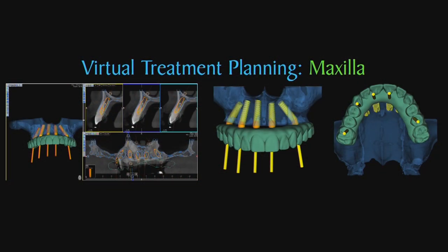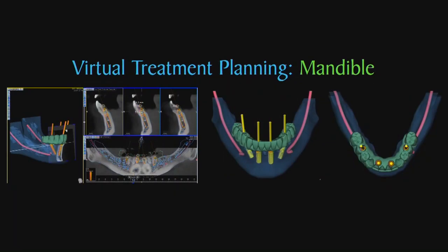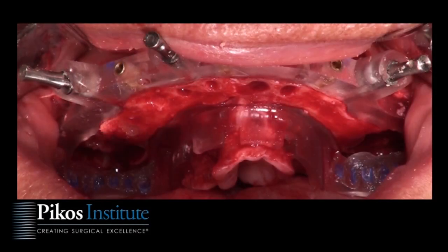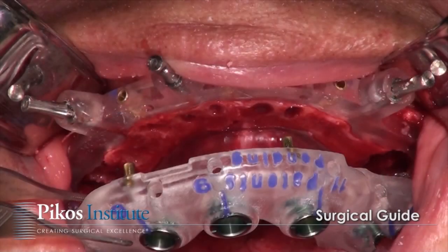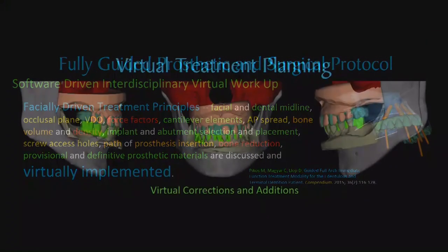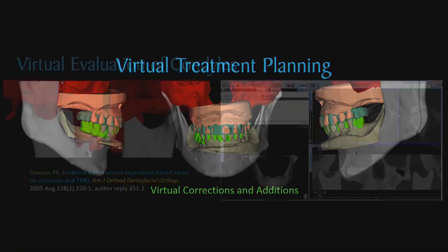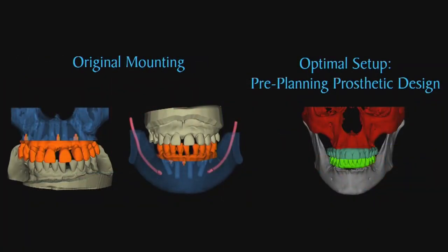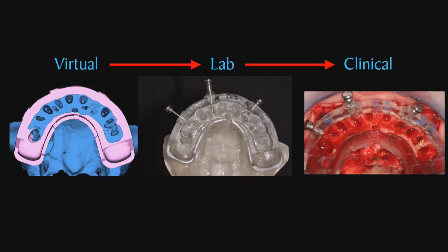And we're verifying proof of concept with regard to the lab component versus the reality, which is the surgical component here. And you can appreciate the bone reduction that's done in advance now of the surgery. I should say it's done at time of surgery, but the planning was done in advance. So this saves a lot of time versus our conversion protocol, where of course we're doing it intraoperatively, still using guides, but this is such a different and better and more efficient approach.